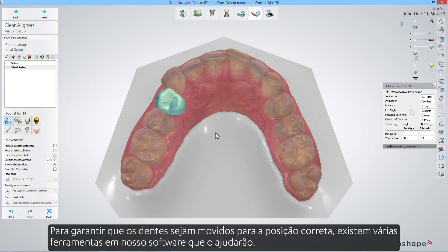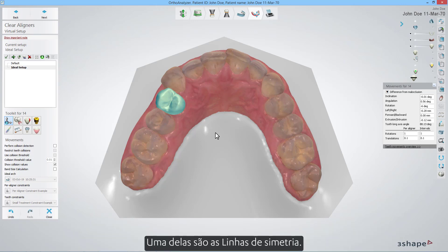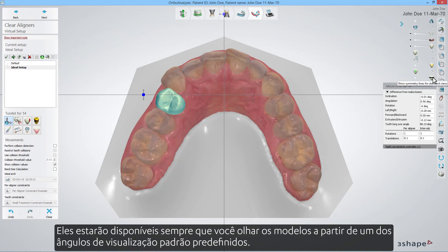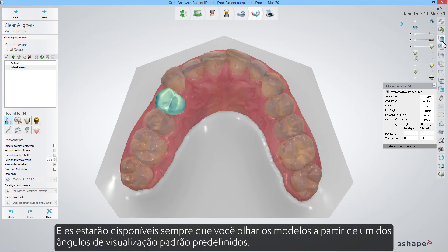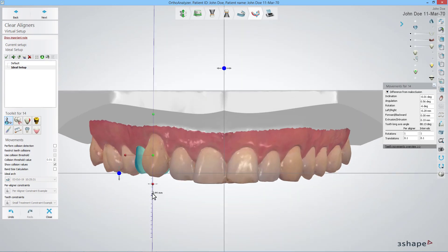To make sure that teeth are moved to the correct position, there are various tools in our software that will help you. One of them are the symmetry lines. They will be available every time you look at the models from one of the standard predefined viewing angles.